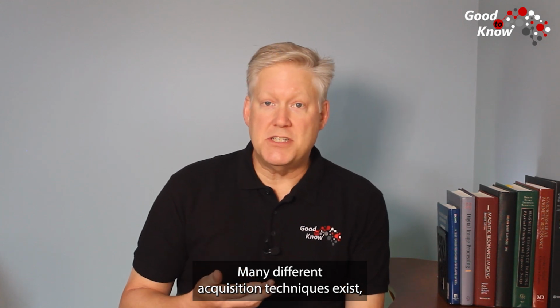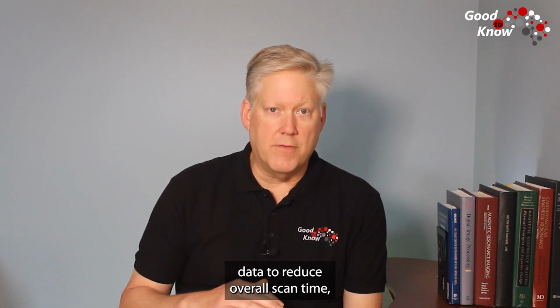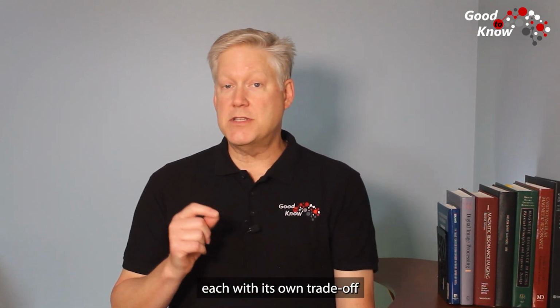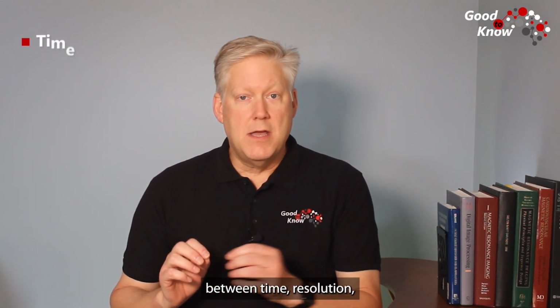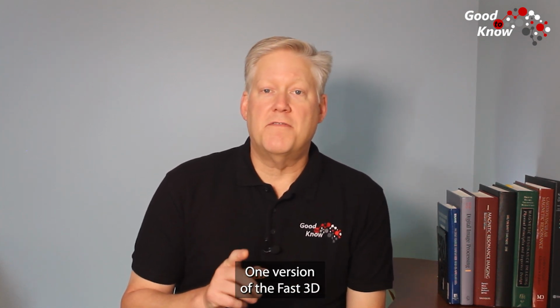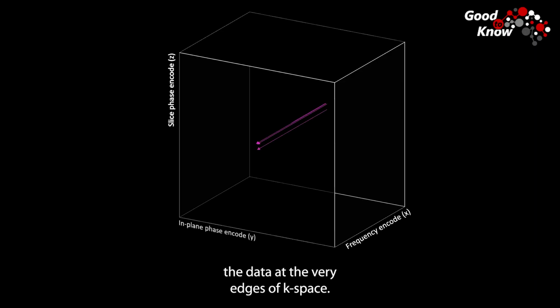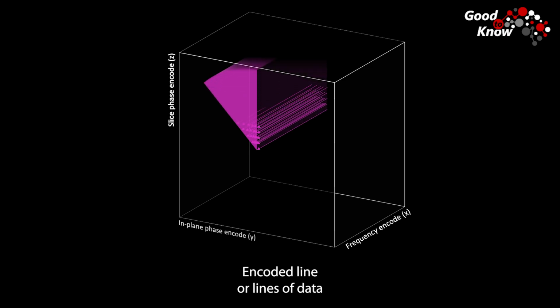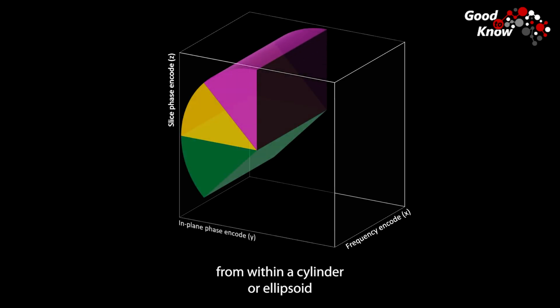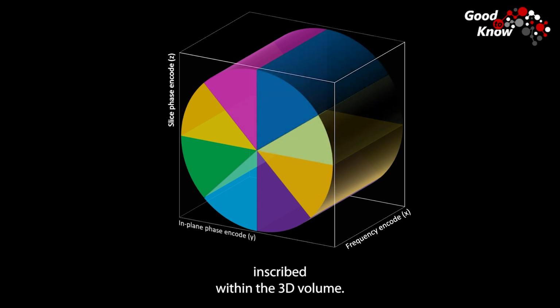Many different acquisition techniques exist, each using unique ways to undersample this 3D k-space data to reduce overall scan time, and each with its own trade-offs between time, resolution, and signal-to-noise. One version of the Fast 3D technique simply skips the data at the very edges of k-space. It does this by acquiring for each phase encoding step a frequency encoded line or lines of data from within a cylinder or ellipsoid inscribed within the 3D volume.